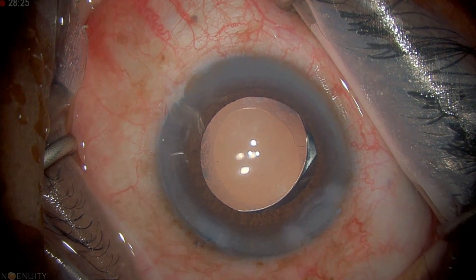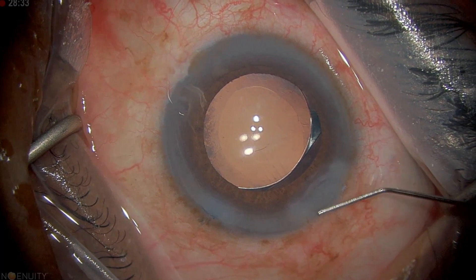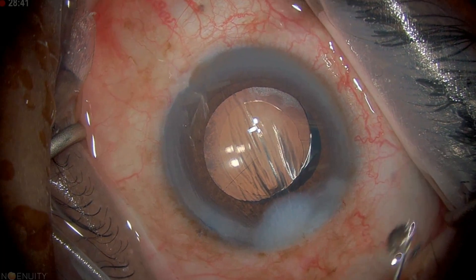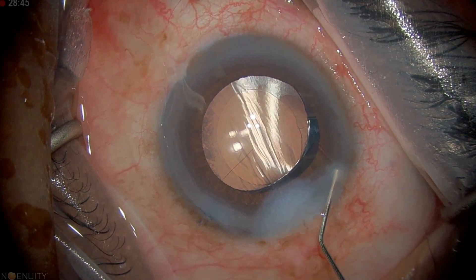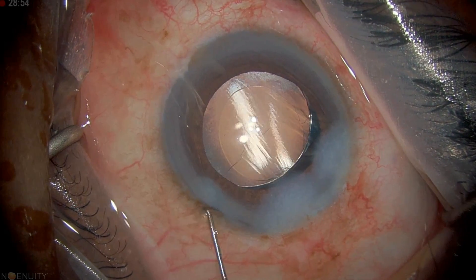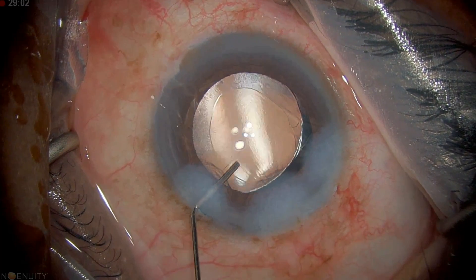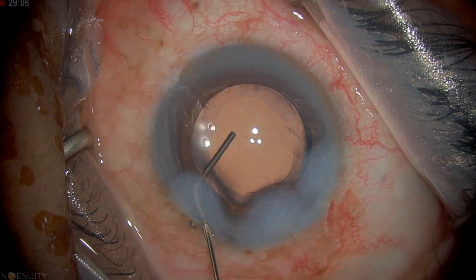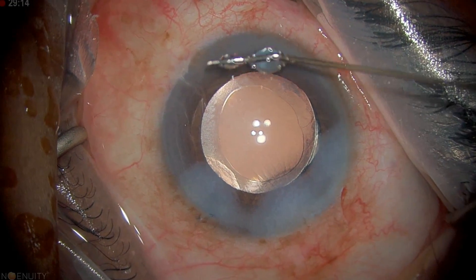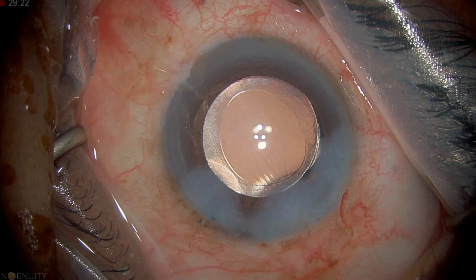We've removed the viscoelastic and now the last step is to hydrate the wound. I like to hydrate only the edges of the wound using BSS on a cannula — with a little pressure I infuse fluid to see the cornea develop some edema as it swells, and as it swells it seals the wound closed. Often just hydrating one side of the side port is enough to close it. I'm happy with these wounds. I'll go in and center the lens to make sure it's nicely centered on the capsulorhexis, adjust the pressure, then check the pressure afterwards. That's a nice pressure and we have nicely sealed wounds — that's the end of the operation.